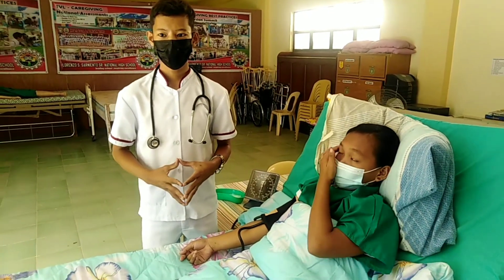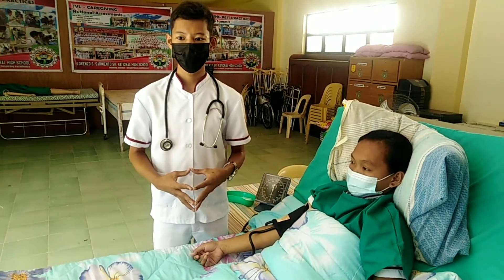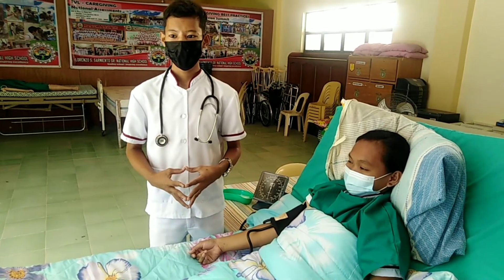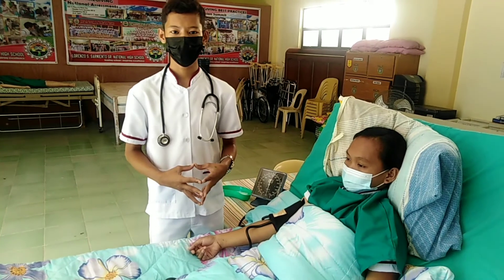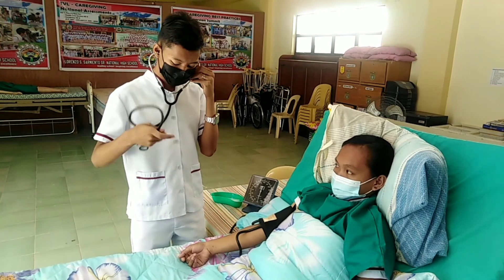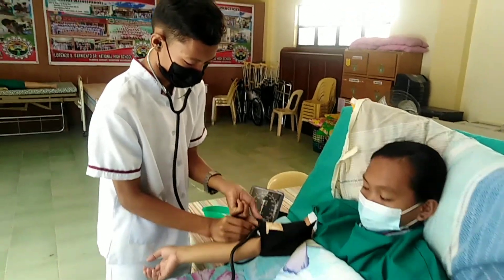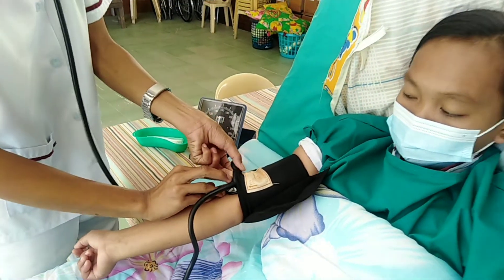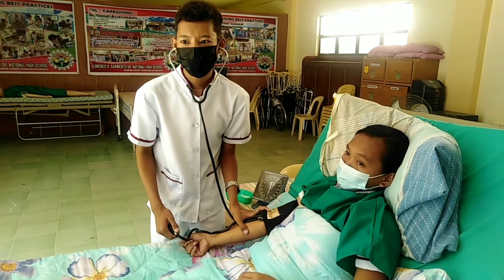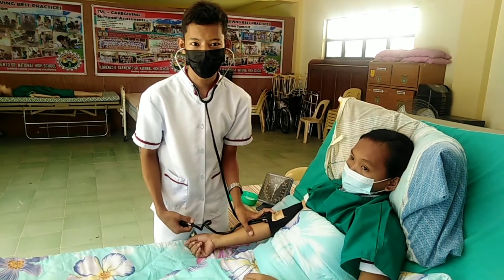Position the stethoscope's earpieces comfortably in your ears, tips facing lightly forward. Be sure sounds are clear and not muffled. Place the diaphragm over the client's brachial artery. Do not allow the chest piece to touch the cuff. Close the screw clamp on the valve and inflate the cuff to a pressure 30 mmHg above the point where the pulse had disappeared.